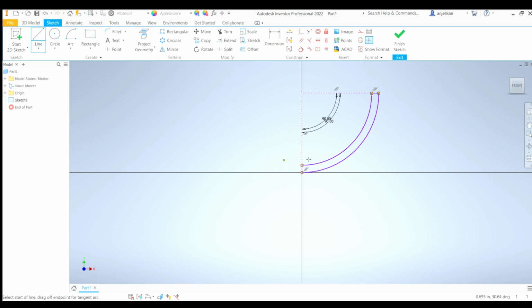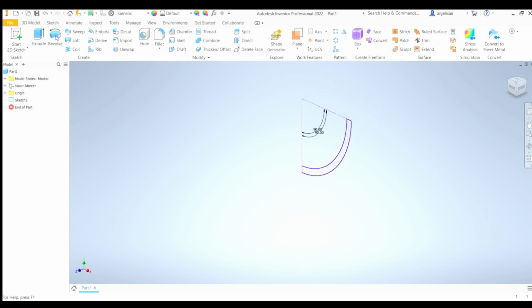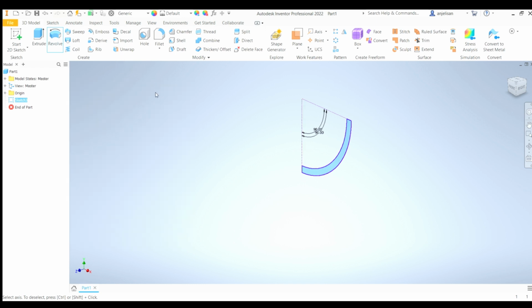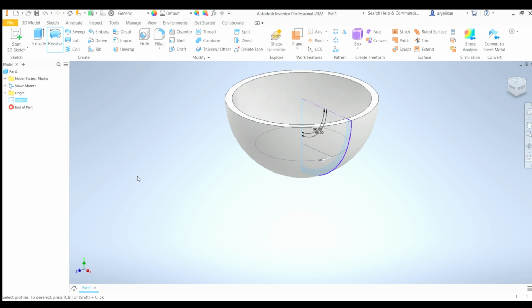So you might be wondering how this little thing can turn into a cup. Well, that's when we finish our sketch and then we hit the revolve feature. You can see that it automatically selected our closed profile for us, but now we have to select an axis. What the revolve feature does is it creates multiple slices of this closed profile rotated around a certain axis. So in this case we're going to be selecting this dotted line here, which is on the y-axis, and there you go, it rotates this cross section around the y-axis, and that's great.